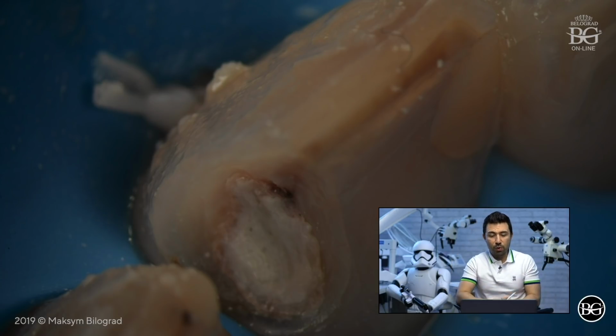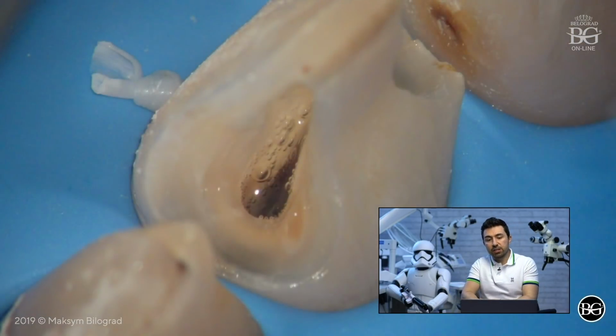Both sides were the same. The cement dressing, and then open pulp, and then necrosis afterwards. I made an endodontic access which was absolutely defect oriented. What does that mean? Once I removed these composite fillings and cement dressing, the pulp chamber was already opened.